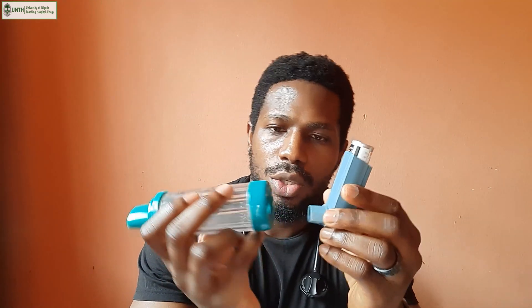When using the aerochamber, make sure you don't breathe too fast — if you hear a noise, that means you're breathing too fast and not getting the maximum effect. To use the aerochamber, prepare the pressurized metered dose inhaler as earlier described: check the expiry date, two puffs in the air to prime if it's new, and shake it before use. Then connect the inhaler to the opening on the spacer device.